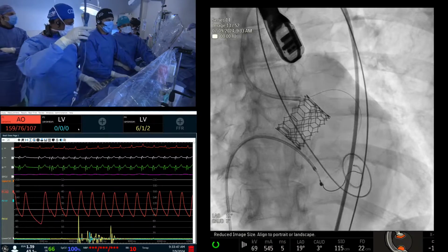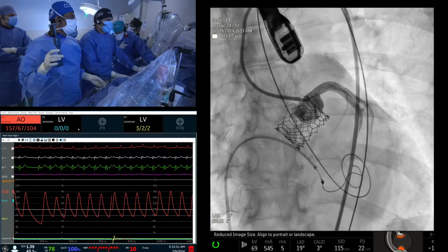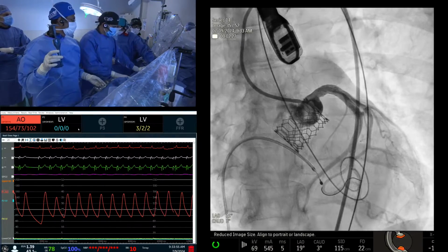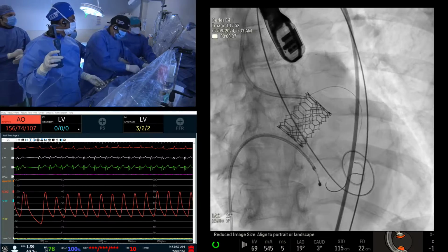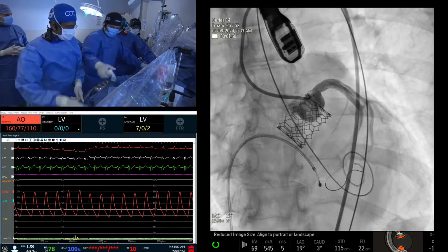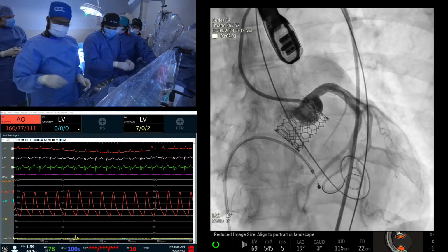Remember, when you deploy the second valve, you do a very slow inflation. I don't want to place a stent because there will be friction between the diamond and the stent and the risk of us not being able to take it out. If we need to put it, we'll do it. No, but what I want to do, one second, because the risk of left main closure is very low. What I want to do is put a stent, see it goes, take it out. Don't leave it. Make sure that it's going.